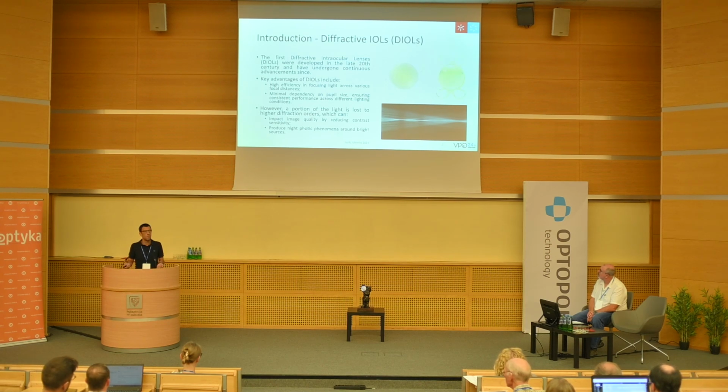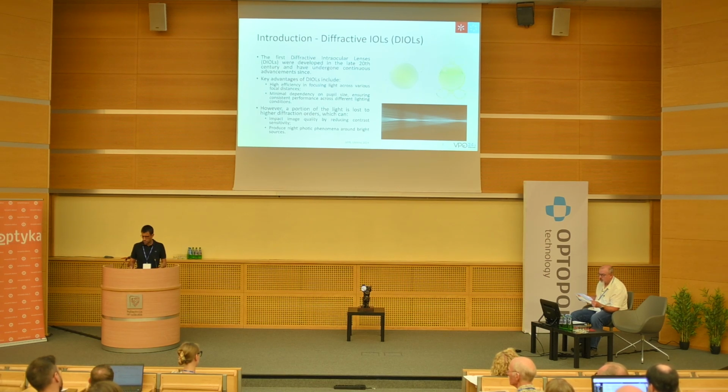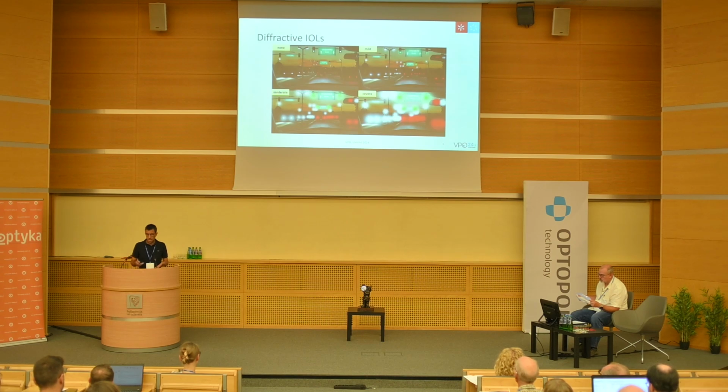But they also come with some drawbacks, including side effects such as night photic phenomena like halos and starbursts, and these are one of the main limitations of these lenses. I think this problem restrains the market from growing more. This is a simulation of the severity that some patients might have with this type of devices.